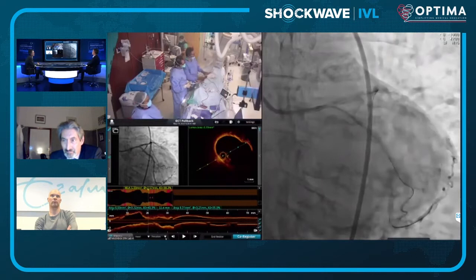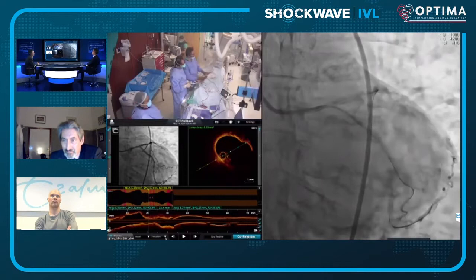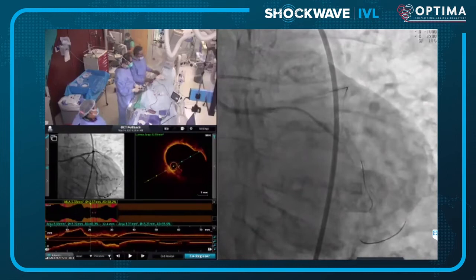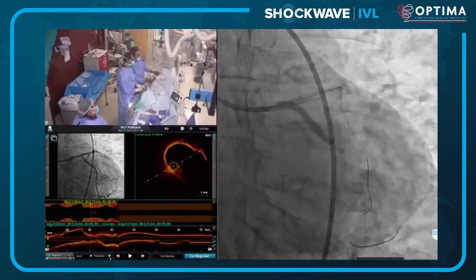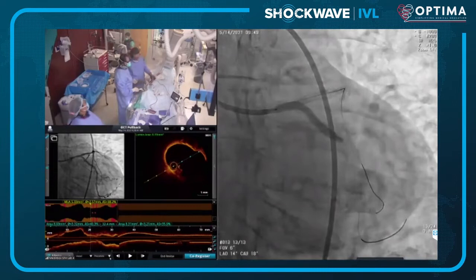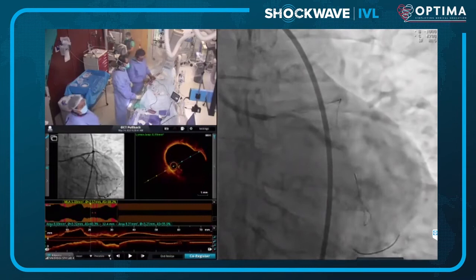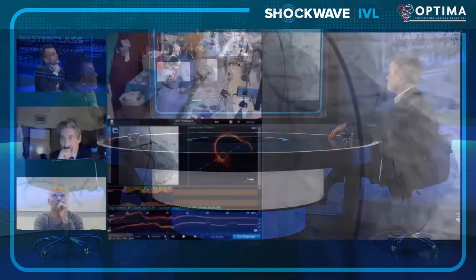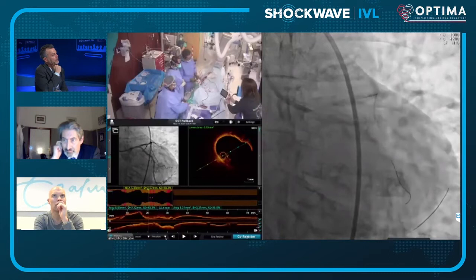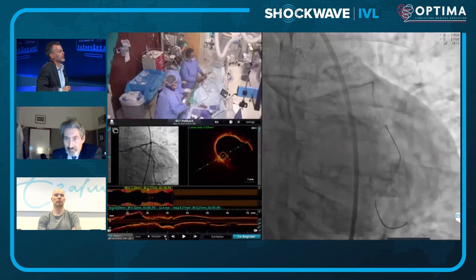Richard deploys the stent. Next steps: post-dilation, then imaging both segments. With a bifurcation lesion, he always images both the circumflex and the LAD. Nicholas: a stent is already in the proximal LAD — you'd be recrossing and POT-ing it. The stent looks pretty good so far, with perhaps a little gap. On the first image there's a concern about the ostium of the left main — a hazy area possibly suggesting micro-dissection.